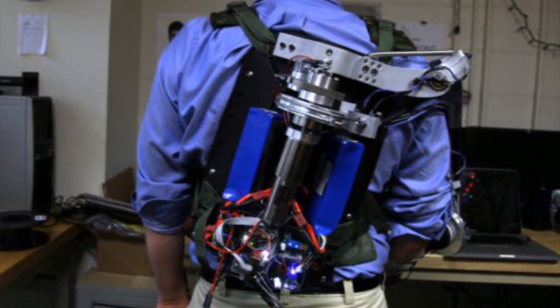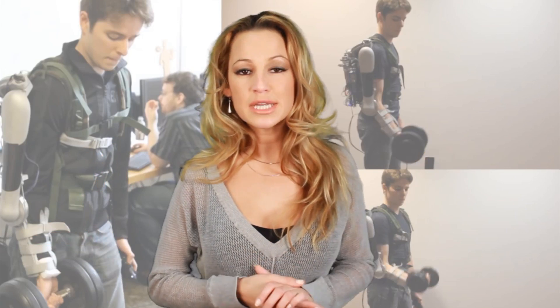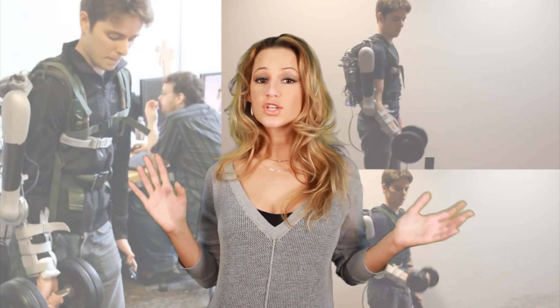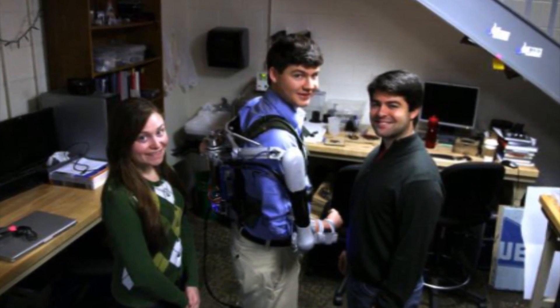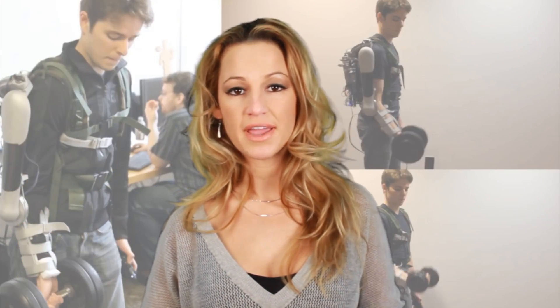It's basically a battery-powered arm brace attached to a backpack. This design has won the team up to at least $75,000 so far. This arm was designed for a school project by classmates Elizabeth Beattie, Nick McGill, and Niko Vladimirov. They're all students at the University of Pennsylvania.